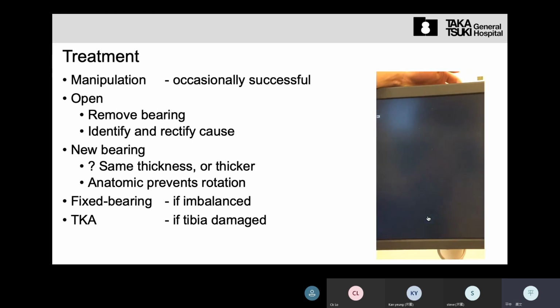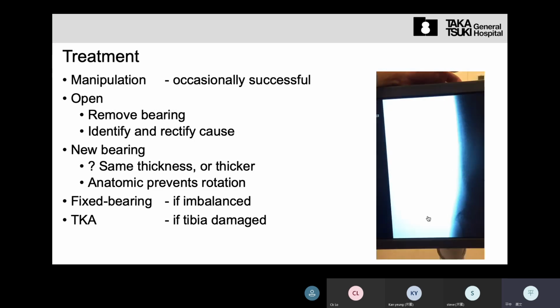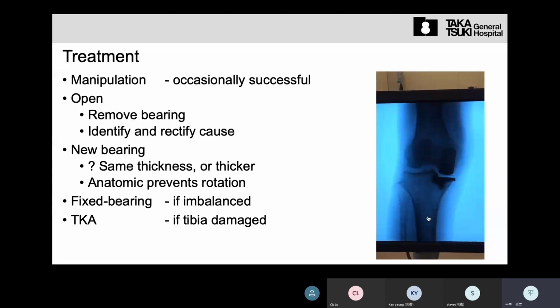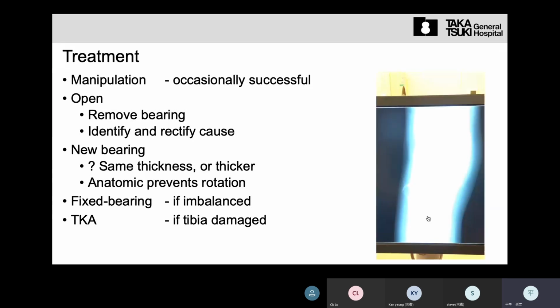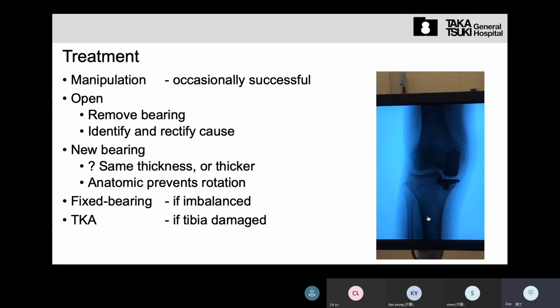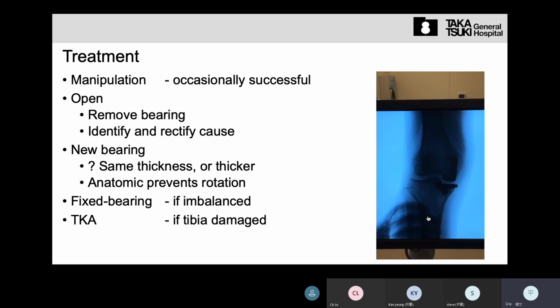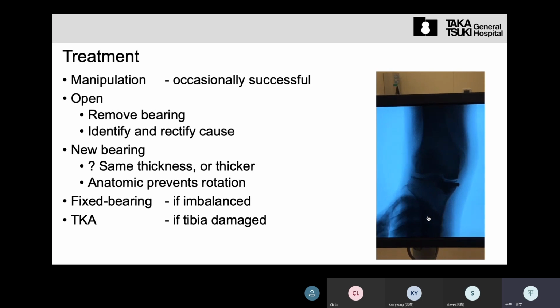So before planning the operation, I strongly recommend you try the manipulation under the fluoroscope once. We don't need anesthesia. If it is impossible, the next step should be open reduction, remove the bearing, and identify the cause.